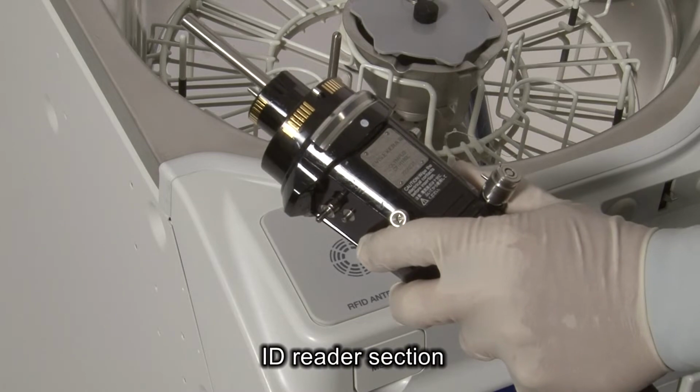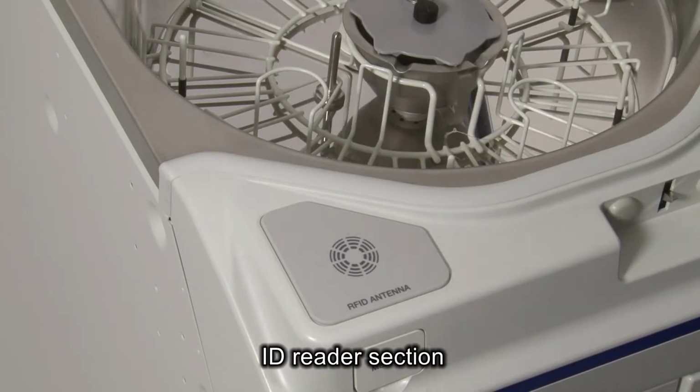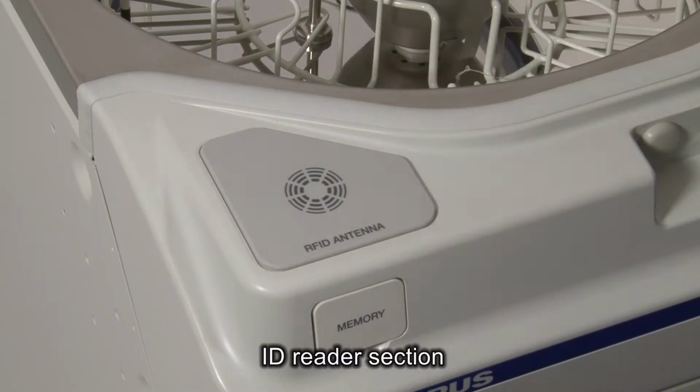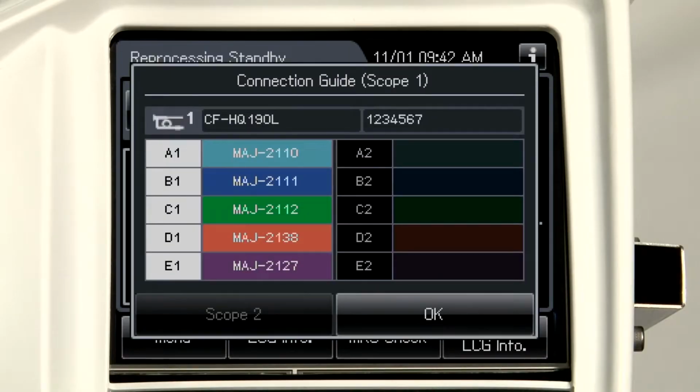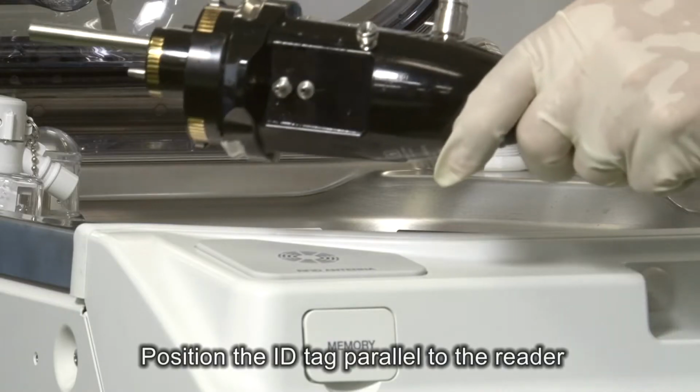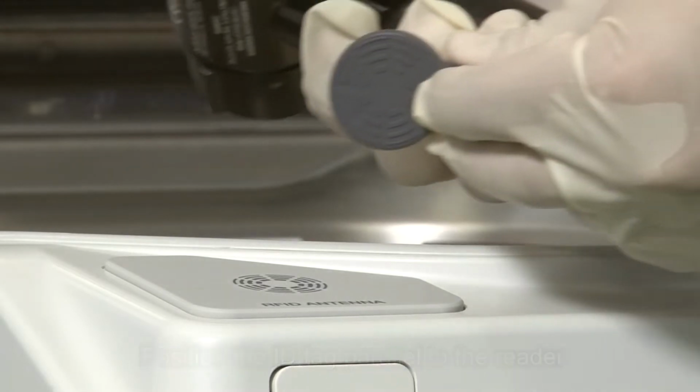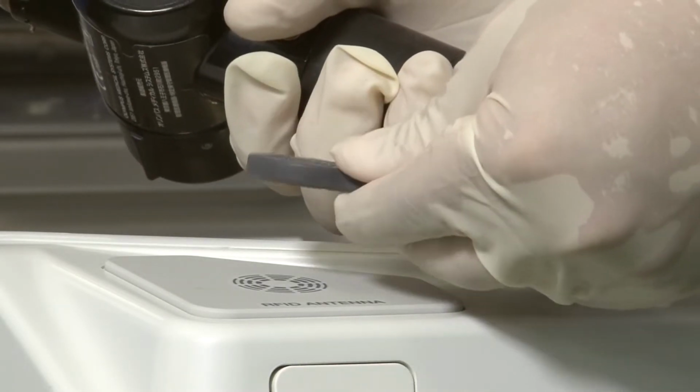Hold the internal ID type endoscope connector or the external ID tag over the ID reader section so that the reprocessor can read the endoscope information. The ID tag does not have to touch the ID reader, but it must be kept parallel to the reader.